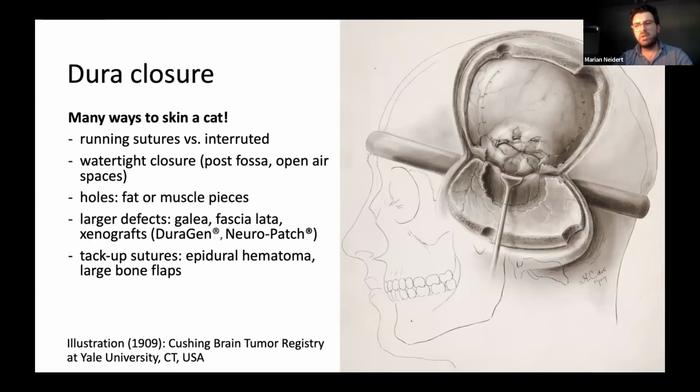Tack-up sutures we only use for cases such as epidural hematoma, or if you have very large bone flaps. But it's not really a routine technique anymore, since the bone flaps, the craniotomies, have become so much smaller, and there's no need for that in our opinion.